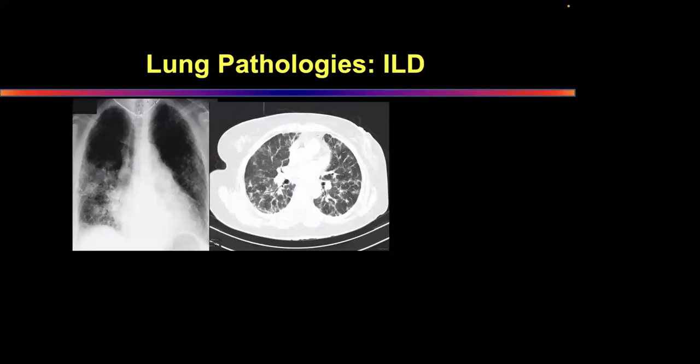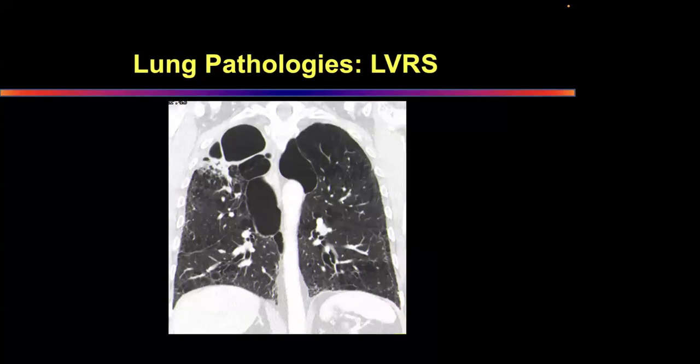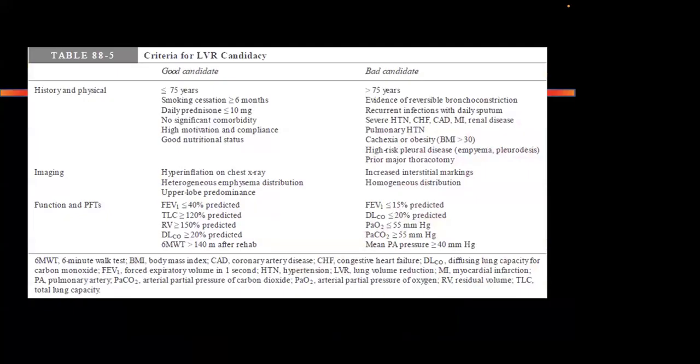For interstitial lung disease, VATS lung biopsy is the gold standard. We always get the answer after doing a VATS lung biopsy in case of undiagnosed interstitial lung disease. Lung volume reduction surgery has excellent outcomes because of the VATS. Earlier, it was done by open surgery. The outcomes were not that great, but VATS is fairly well tolerated by the patients with good outcomes.